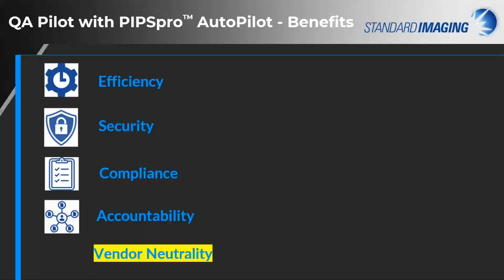We meet you where you are today and, of course, are building you towards the complete standard imaging solution, as we, of course, firmly believe that we have the best products to get the jobs done that you need done efficiently, accurately, and precisely.